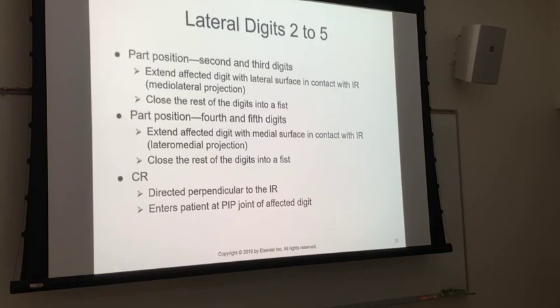The marker's not going to cooperate with me very well. So just looking at the shadow, not looking at the cap or the marker itself, does that look like it's lined up? It looks like it's a little bit separated, but does it look like it's lined up this way? Yes. So if I turn it though, does it still?